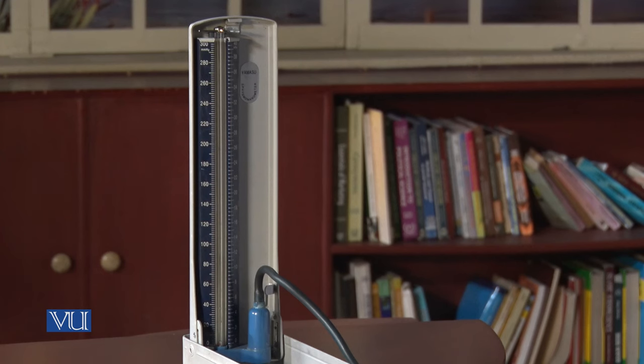The first knocking sound is the subject's systolic pressure. When the knocking sound disappears, that is the diastolic pressure. The subject has normal blood pressure, which is 120 by 80 millimeters of mercury.